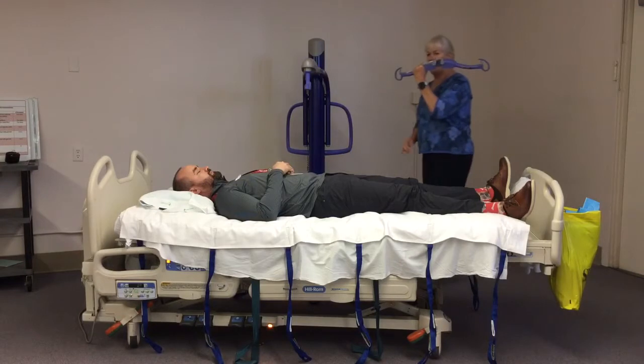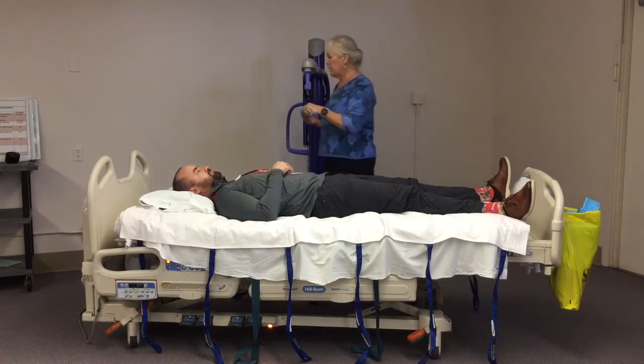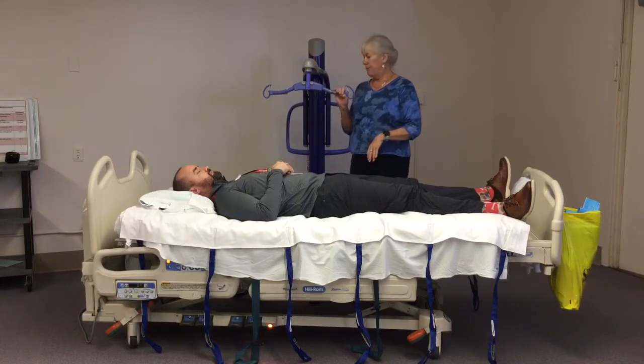This is your 2-point spreader bar. It's for the loop slings. Face that smiley face to you. Step in close to the machine, lift up and down, and now it's in place.